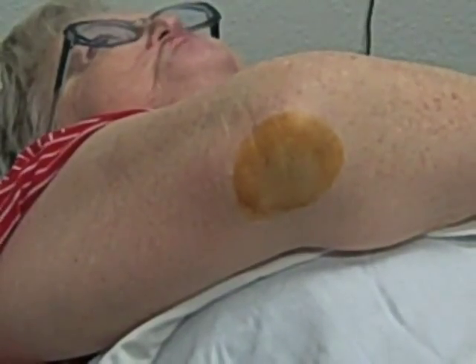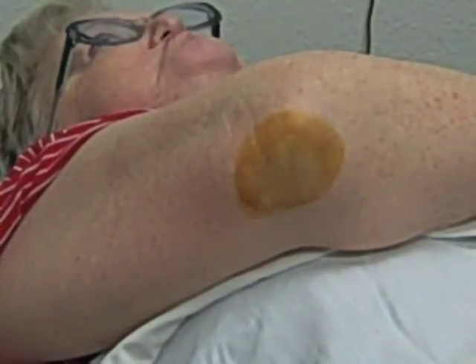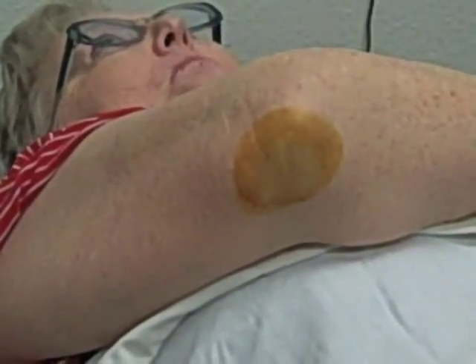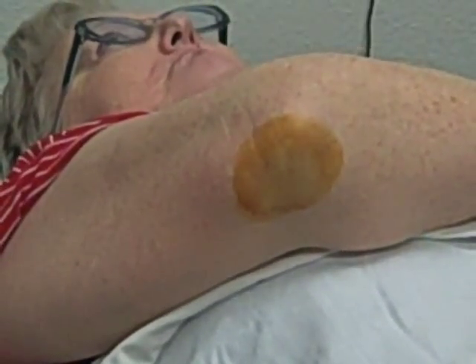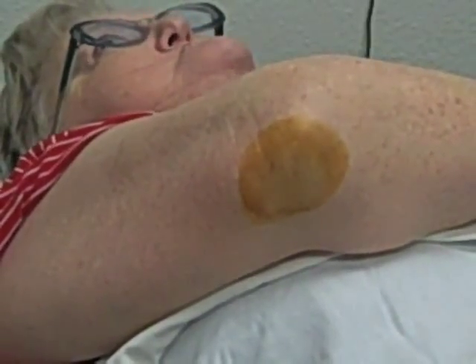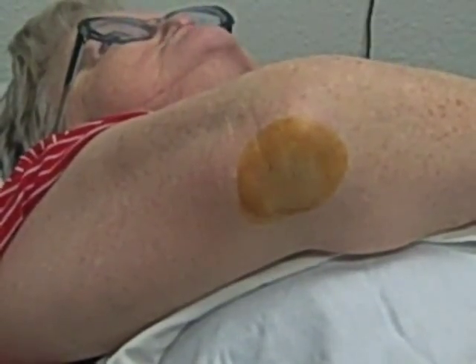The patient's skin has been prepped with betadine. We've also used alcohol to clean off the excess betadine. The medications we're going to be using today are a mixture of 20 milligrams of Kenalog and 1.5 milliliters of 1% lidocaine, using a 25-gauge needle, one and a half inches long.